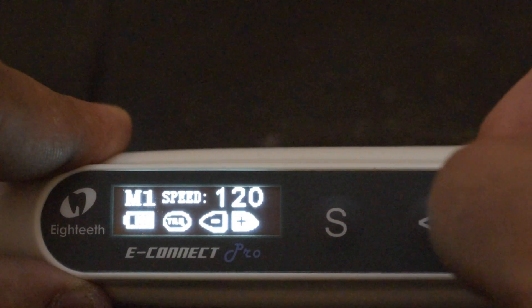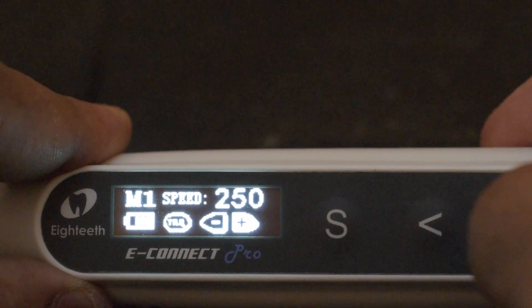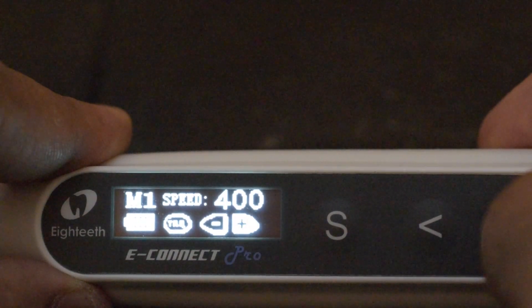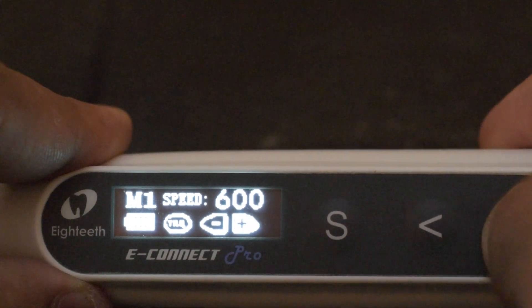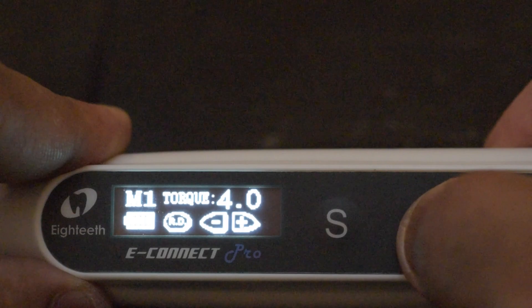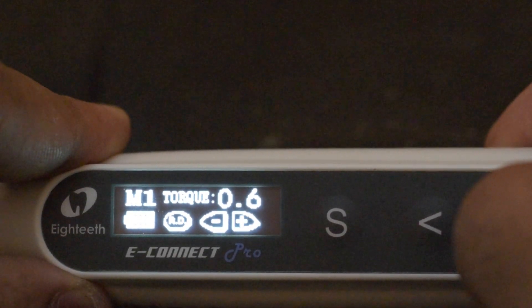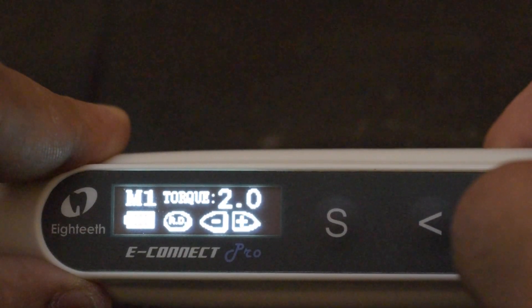This motor gives you control over speed from 120 to 650 RPM — that's an amazing range of speed for this small device. Coming to the torque setting, the torque ranges from 0.5 to 4.